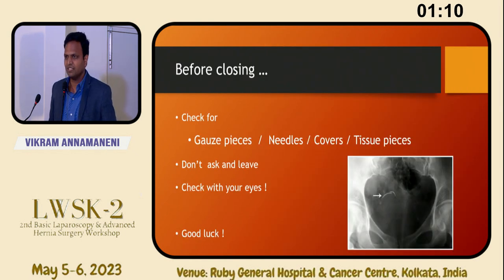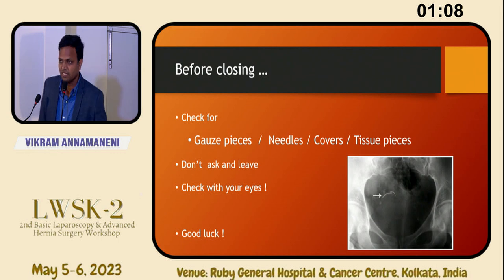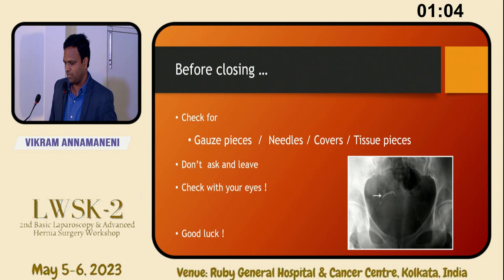Before closing the abdomen, and also my talk, check for gauze pieces. Check for needles. Check for endo covers. And also check for tissue pieces. Don't just ask the sister, gauze out? Don't just ask and leave. Check with your eyes. I have one experience. I asked the sister, is the needle out? Yes. But I found that the needle was there in the port in the next surgery. So we should check with our eyes.